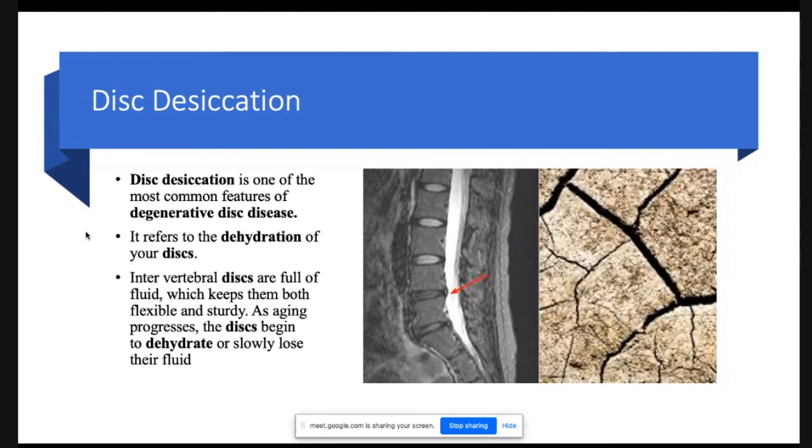Now we'll come to the most important and core point of MRI reading related to the C spine or lumbar spine. Every time we interpret the reports, these terms will often be present in the report, and we don't know why they are so important, or why they are repeatedly explained. We may be astonished when we are a final year student or in an internship, exposed to this. At one point we'll feel that all these are the same. Why is the specification written as L4, L5, L1, L2, L3, L4, L5? They could have written just the whole lumbar vertebrae, but it has something very important, and let's discuss how beautifully we can treat based on these reports.